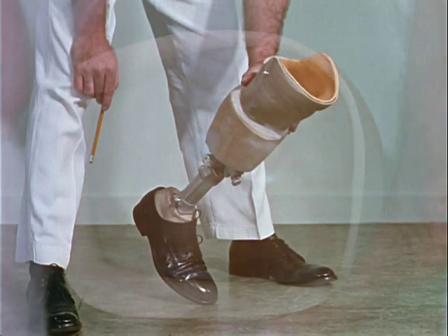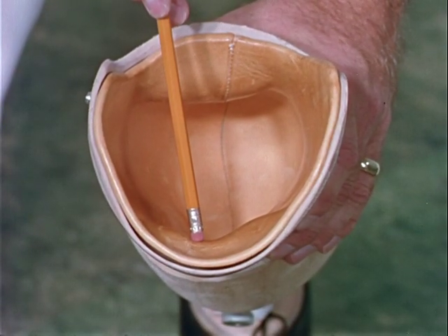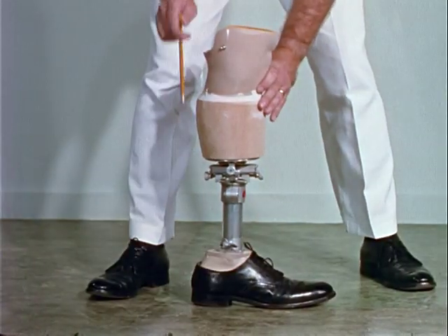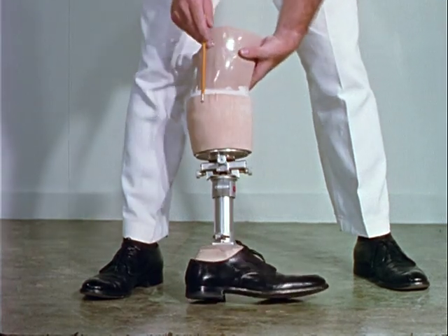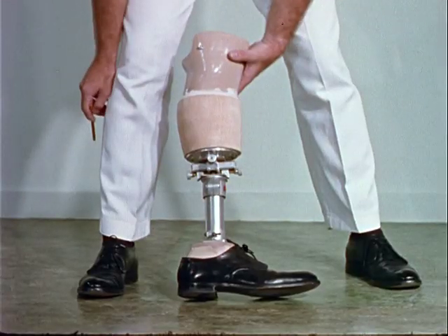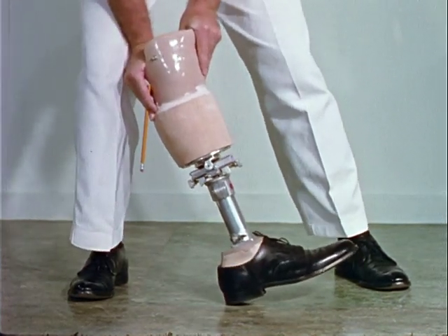With the patellar tendon-bearing prosthesis, the weight is borne at the midpoint of the patellar tendon. The popliteal bulge forces the stump forward onto the weight-bearing surface. The socket is set in approximately 15 degrees of knee flexion. Initially, the prosthesis contains an adjustable shank which allows periodic realignments to be made before fitting the patient with the final prosthesis. Both limbs are fitted with the solid ankle cushion heel foot, or SACH foot.